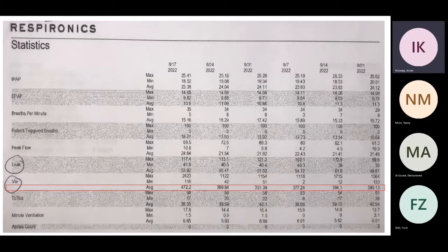So here it was fine. And then if you see, it's starting to drop, or maybe not bad, not like the case that I showed you, but at least it's not where it needs to be. So reaching your maximum pressure and you are not achieving the goal. Why? In this situation, one of the reasons is the wrong prescription. Or maybe I shouldn't say wrong, but anyway, the prescription needs to be changed.